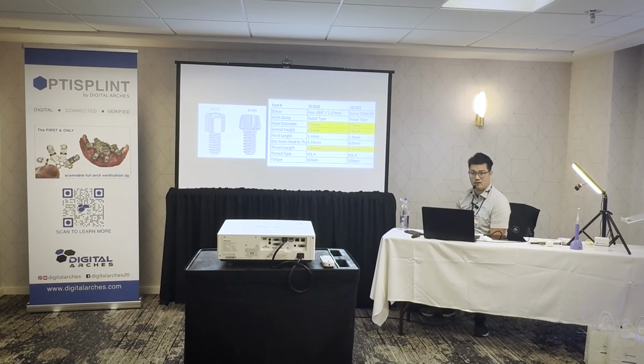Because again, like we all agreed, tie base debonding is not an epidemic. If you have passivity, if you use the right primer, if you cement things properly, you're not going to get tie base debonding, except for cases where we have a weird cantilever or something like that.